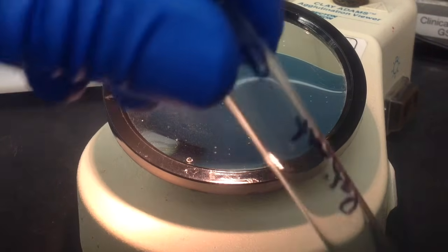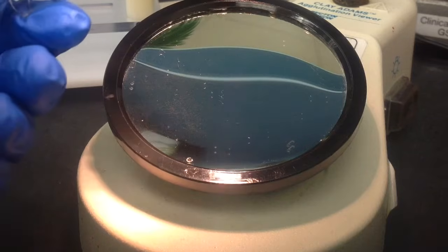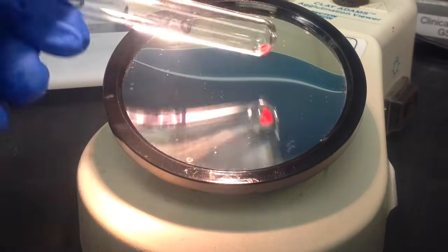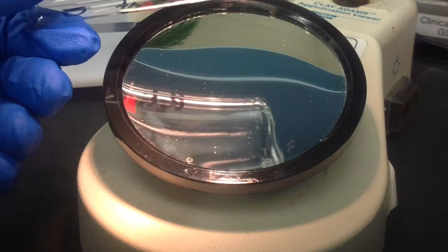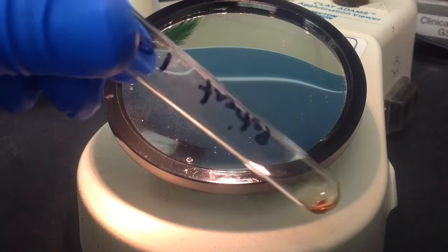And then moving on to the anti-D. Now, this is the first one we're going to get a positive with. You'll see that this has a 4-plus, really good cell button agglutination right there. And from that forward, you know this is an O-pos patient.